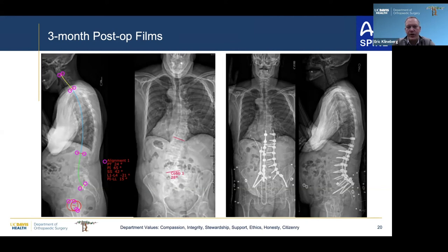So I do think the L5-S1 level is much more prone to fracture and late complications. So I do like having some sort of interbody graft in there, particularly if there is a disc space still available. ALIF, TLIF, PLIF, I don't really care, just something to get something in there, because I do think those rods see a lot of stress. And then I'm probably using more rods as I continue to go on, just because I'm seeing those late fractures. And there's nothing that humbles you more than long-term follow-up.